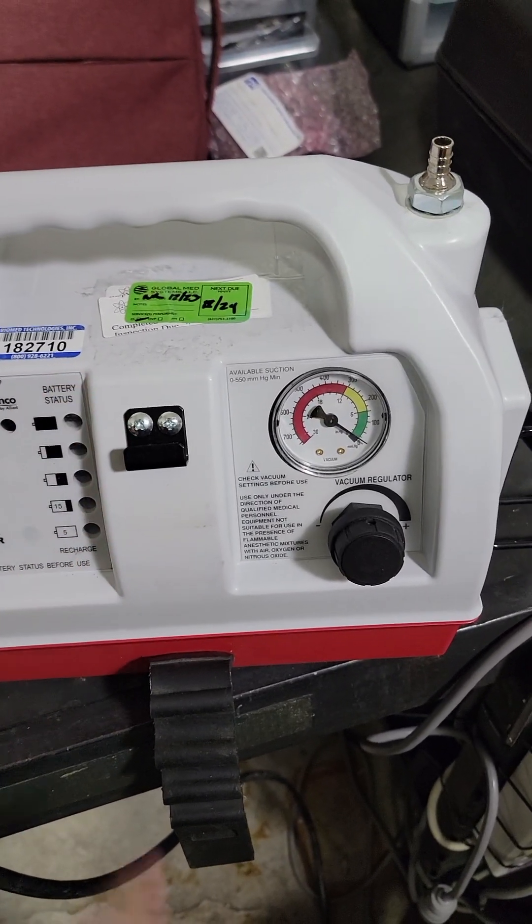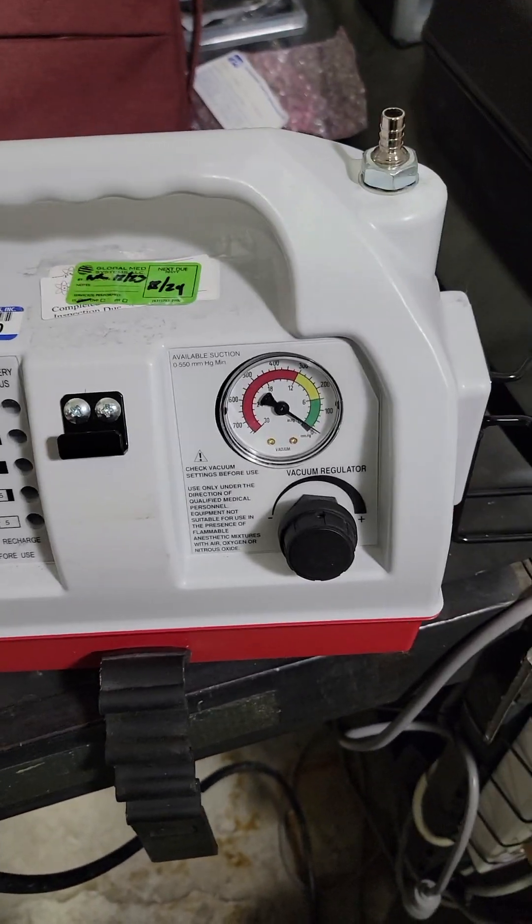When plugged in you'll see the lights on — works, of course. You unplug it, turn it off — should be obvious. Dead battery.